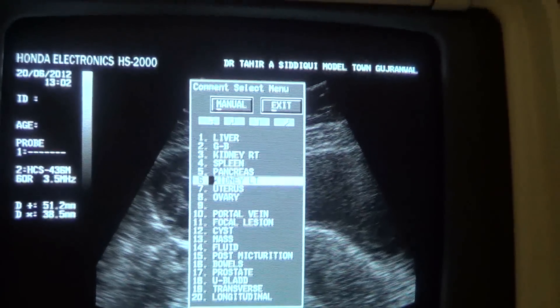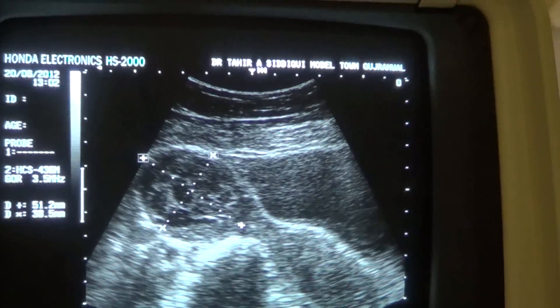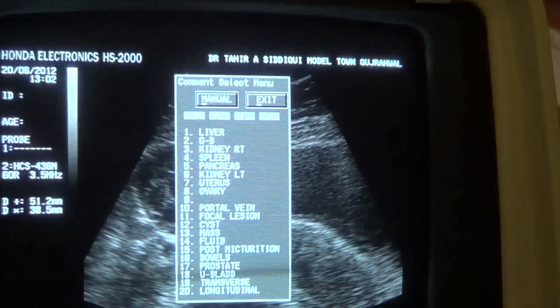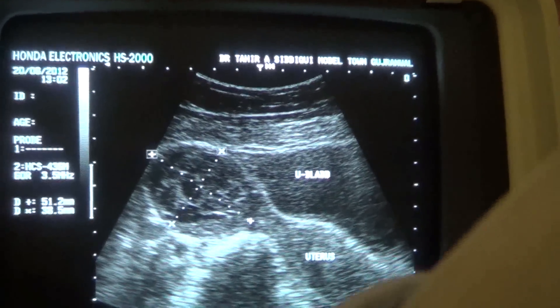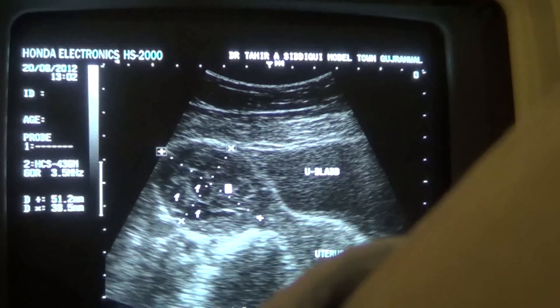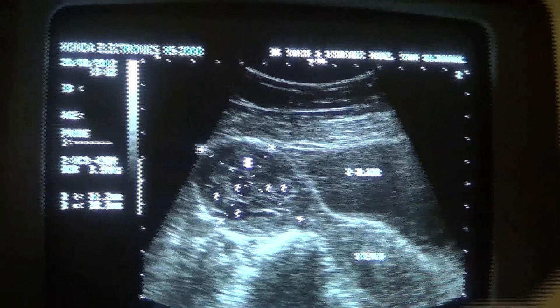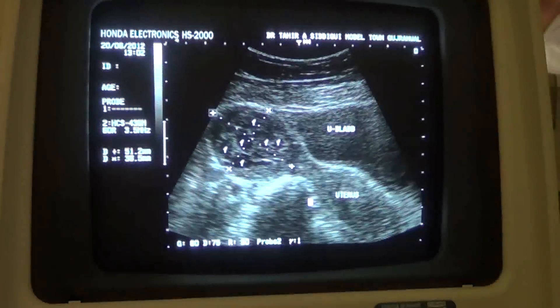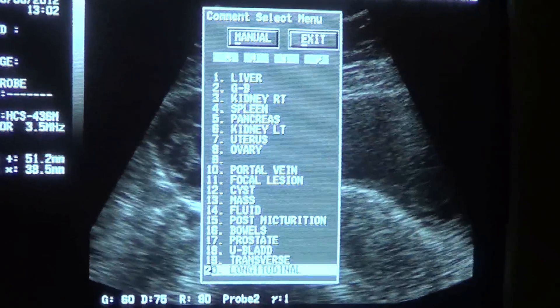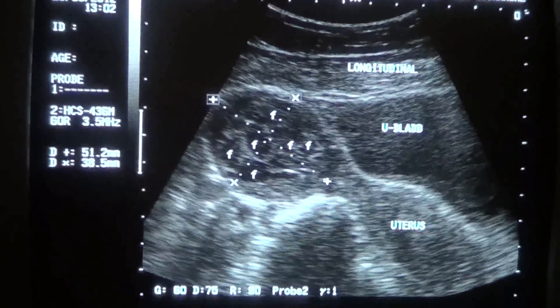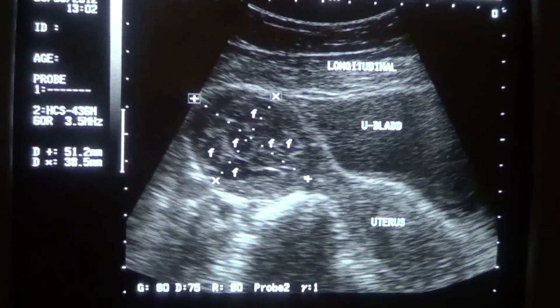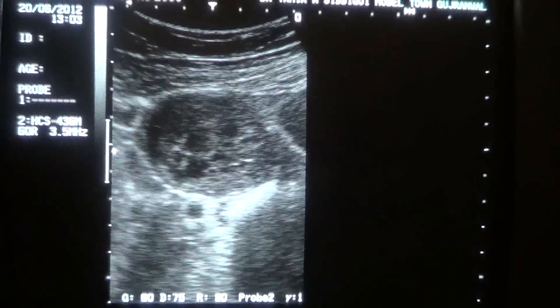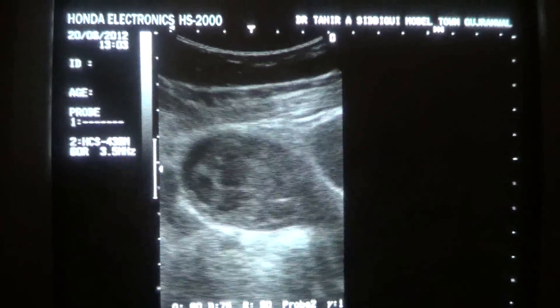This is the outer surface of the ovary. This is a follicle, this is a follicle, these are follicles. This is a small amount of fluid. So there are multiple follicles, and this is the longitudinal section. You can see the ovary with multiple follicles.